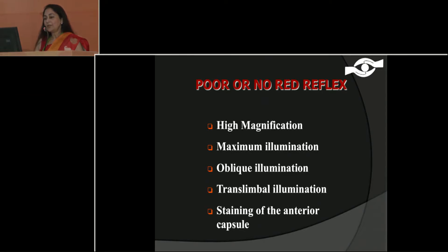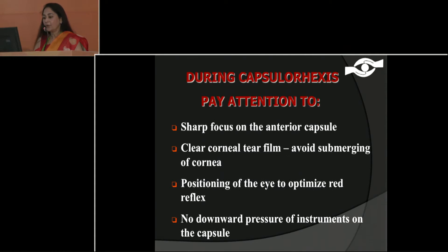Important here: you must have high magnification. For beginners, it is very important to have a good microscope, maximum illumination, and staining of the anterior capsule. During capsulorexis, you have to pay attention to sharp focus of the anterior capsule. You should always have a clear corneal tear film — avoid submerging the cornea with a lot of fluid — and position the eye correctly. The key art is: do not have any downward pressure of instruments on the capsule.